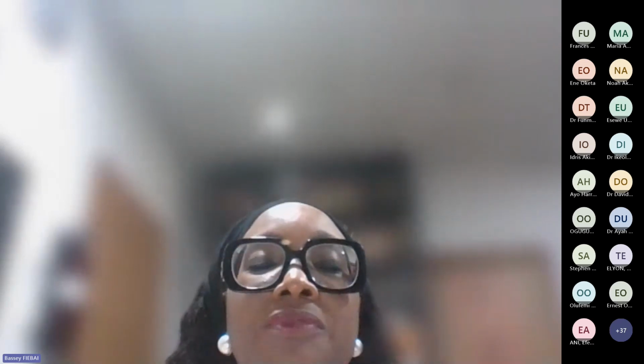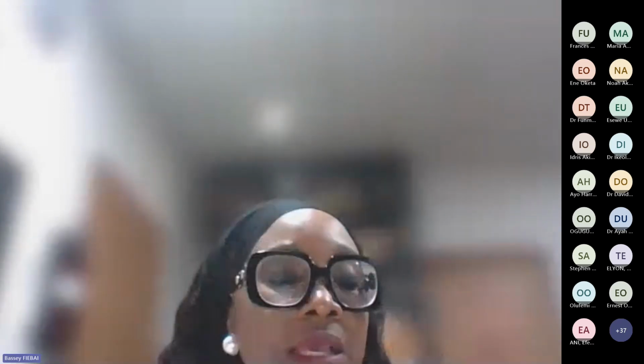So as much as possible, let every ophthalmologist do their own scan right there, just like doing the fundoscopy in the clinic, because what the echographer gives you may not even be what you want. The echographer cannot possibly print out every echogram. That's why it's also important that you give the echographer the right information. Do you want them to focus on the left eye? Though both eyes must be scanned, the study eye will be focused on, so that the person gives you the important information.